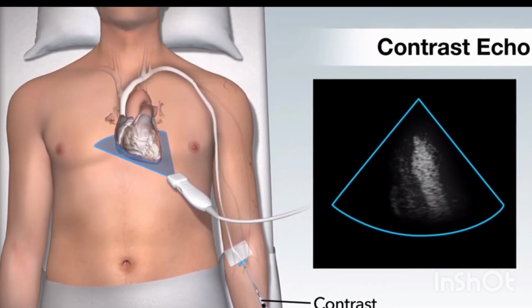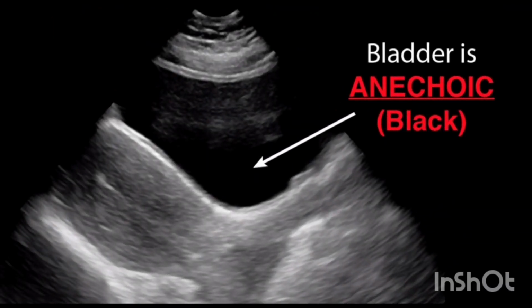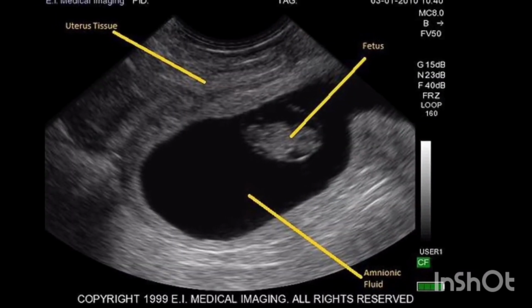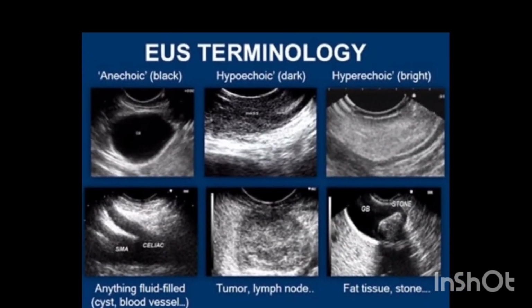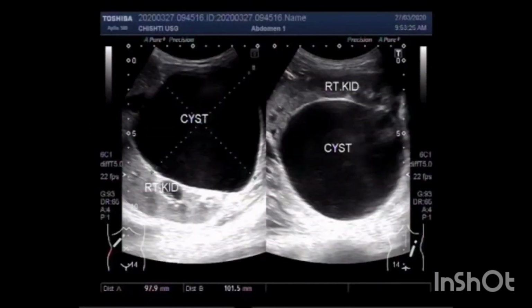The density of the tissue dictates the speed at which the echoes return. If you remember that fluid is always black and tissue is gray, the denser the tissue is, the brighter white it will appear in ultrasound, the brightest white being bone. After learning that fluids appear black, tissue appears gray, and bone appears white on ultrasound, now we need to understand the terms which are generally used.